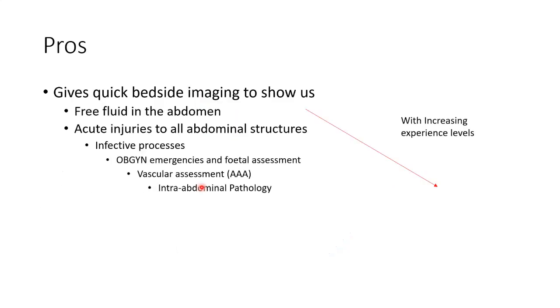So what are the pros of it? It gives us quick bedside imaging, very quick. I mean, it takes nothing. In our department, we just have to wheel the ultrasound from one side to the other, plug it in. It needs a new RAM card because it takes a damn long time to actually boot up. It feels like it's forever, but in reality, it's only about 3 or 4 minutes until it's booted up.